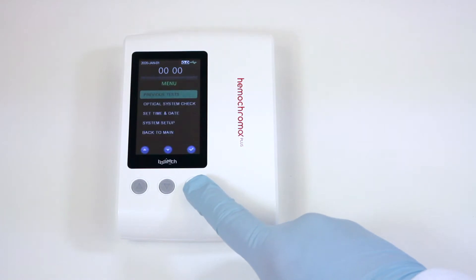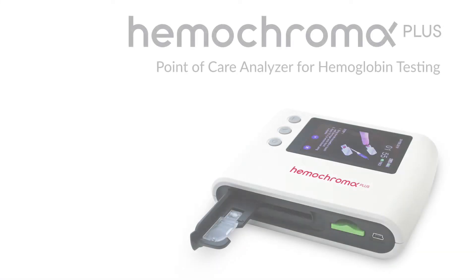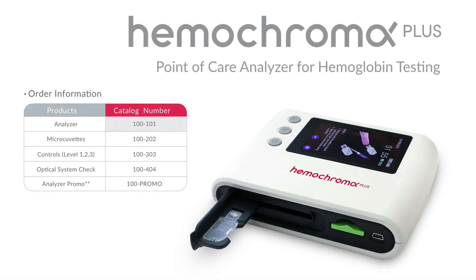To power down, press the Power On-Off button. The Hemochroma Plus Analyzer will power down. The Hemochroma Plus Analyzer item number is 100-101. For more information, visit us on the web at Immunostics.com.